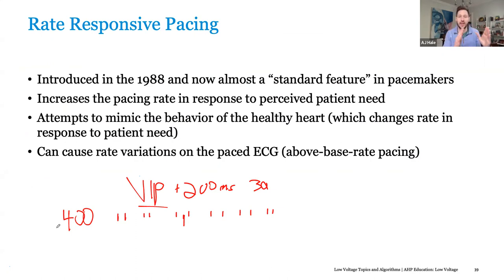So the patient could have normal healthy conduction and degrade over the course of 10 years. And you may just extend that AV delay out when you see them to kind of compensate for that until it gets to the point where it's too long, and then just shorten it up and consider them as a CRT candidate if you start to see degradation of their heart failure symptoms or their cardiac output starts to go down. So, make sense?